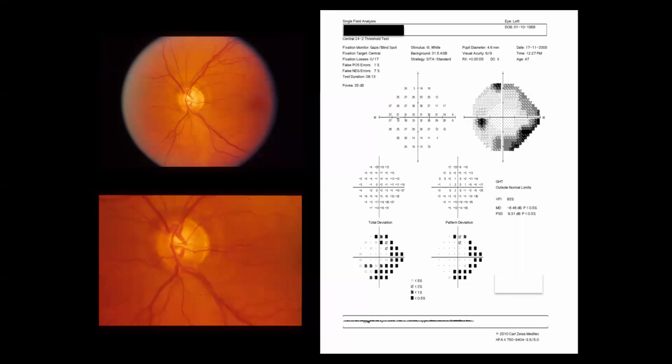So when we talk about bright and dim stimulus, in visual field, it's the opposite. If you have higher numbers, it means that it's a dimmer stimulus because you are talking about decibels. If you are having lower numbers, then these are brighter stimuli. Yes. So 100% correct. Can you complete, please?